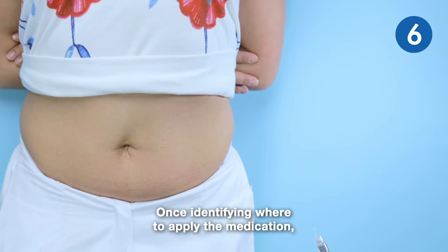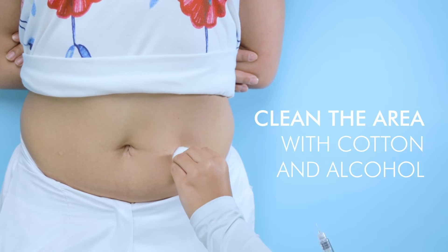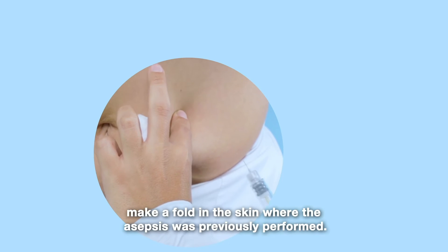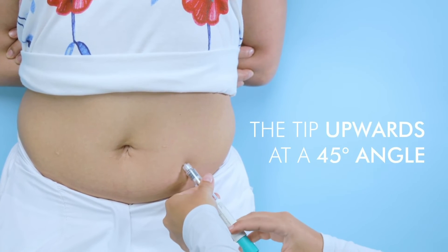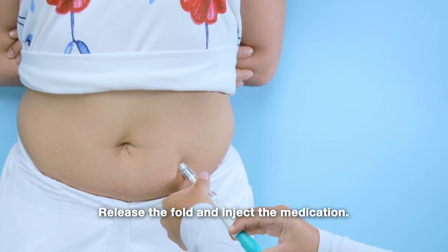Once identifying where to apply the medication, clean the area with cotton and alcohol. With the thumb and index finger make a fold in the skin where the asepsis was previously performed. Take the Avidrel pen and introduce the needle with the tip upwards at a 45 degree angle. Release the fold and inject the medication.